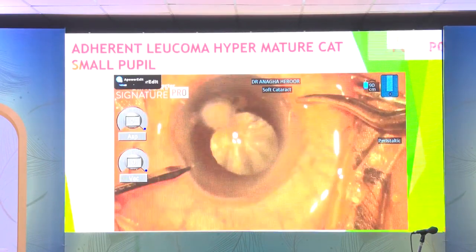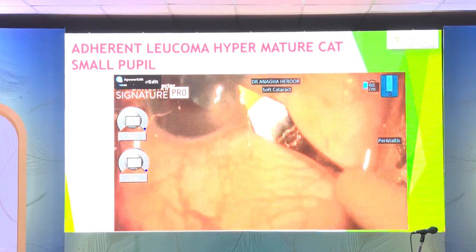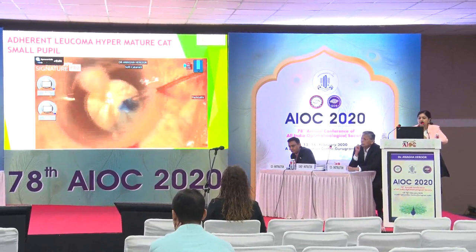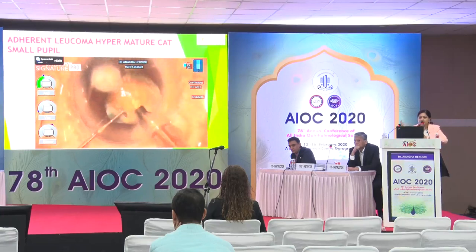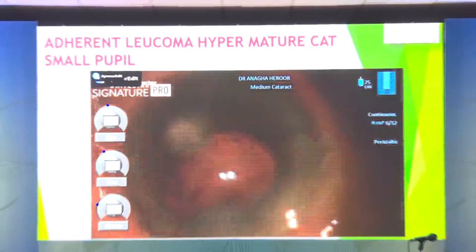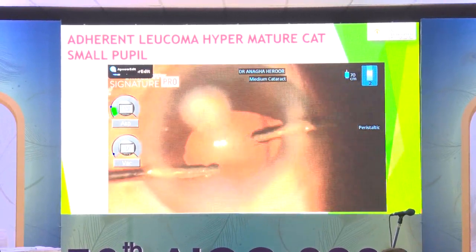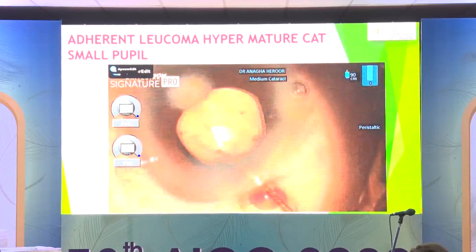There are cases like adherent leucoma with hypermature cataract where you cannot use any pupillary expanding devices because inferiorly it's not going to expand much. We stained the anterior capsule with trypan blue. The rexis must be just inside the pupillary edge — be careful as it's already a mature cataract and you can easily get a runaway rexis. You need to remain in the center during FACO so you don't inadvertently catch the pupillary edge. Finally, nuclear FACO emulsification, irrigation aspiration, and lens placement are completed.